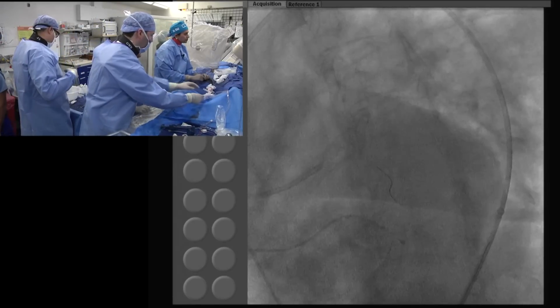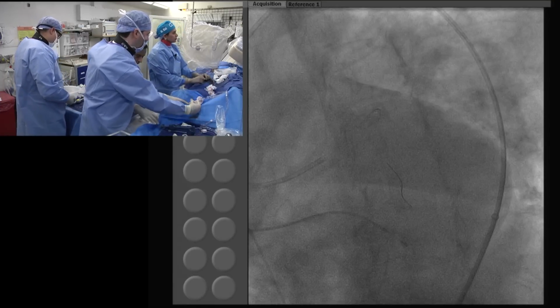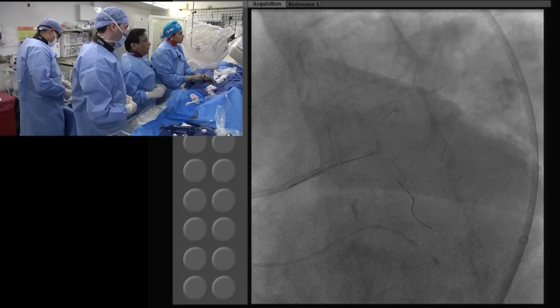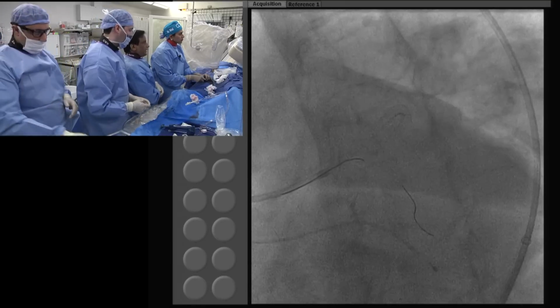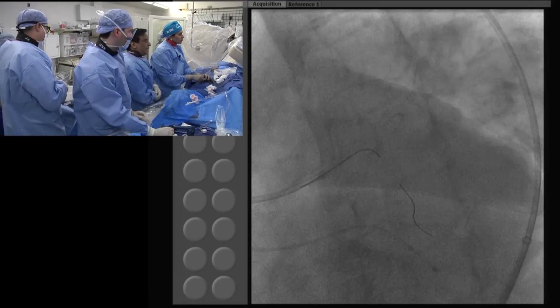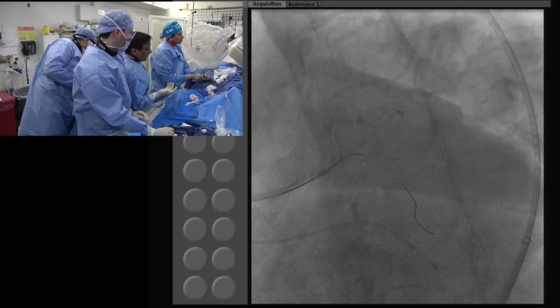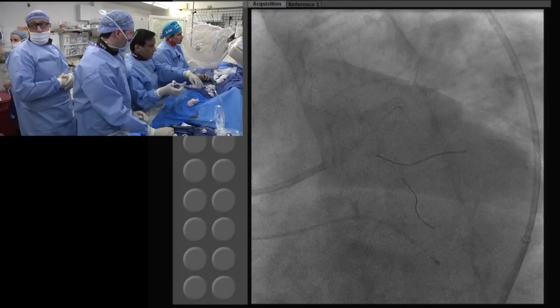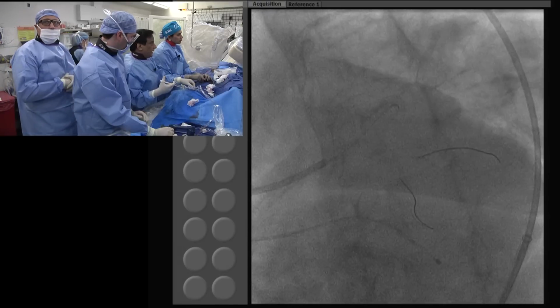I always say that any time you do it as a bailout it has a lesser impact on overall outcome compared to doing it electively. That we learned for the balloon pump, we learned for the impeller device, and all these cases. Once you decide, you should do it. Now, rare case, when an acute complication occurs, what do you do at that time? If the patient had a low ejection fraction and for some reason you didn't want to put in an impeller, which should have been a clear indication, that patient could still die.